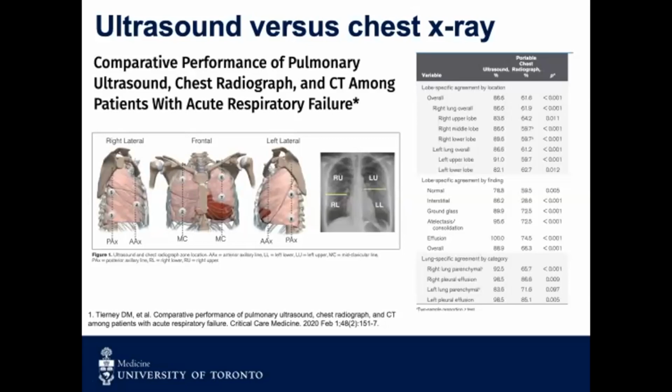All lung ultrasound examinations were performed and read by physicians who had 3+ years of experience, and there was a 1-hour session prior to classifying to just refresh the zones that they were looking at. So on lung ultrasound, the zones were identified as either A, normal, so the presence of A lines, which we'll discuss a little bit later in the presentation, or abnormal.